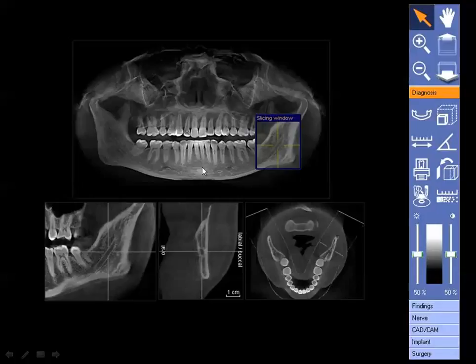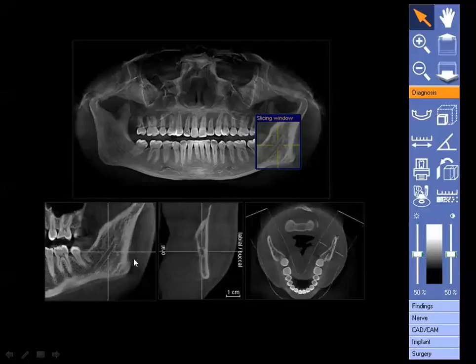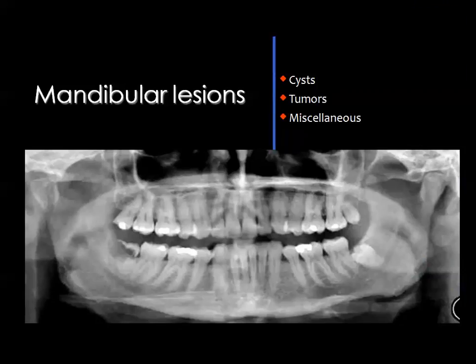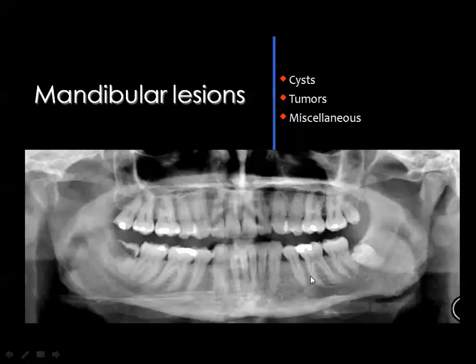After obtaining the 3D image from cone beam CT, you can select the desired part to be further evaluated in axial and coronal planes. This is 2D cone beam CT of the mandible; if you want to look carefully at the area of the mandibular canal, you select that area and the scan gives you more detailed images in axial, coronal, and sagittal planes. Cone beam CT can examine the paranasal sinuses, mandible, alveolar margin, and related structures in bone and soft tissue window settings.